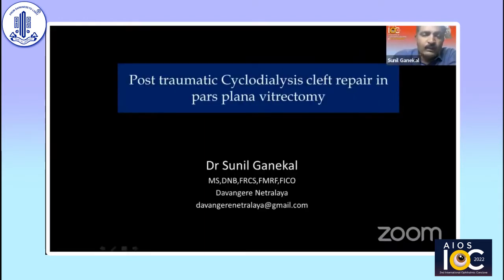Okay. So today, basically, I'll be talking to you regarding post-traumatic cyclodialysis, how to manage cases of cyclodialysis clefts associated with retinal problems.